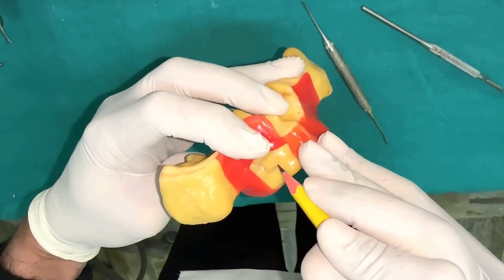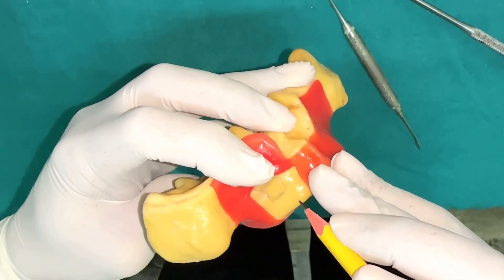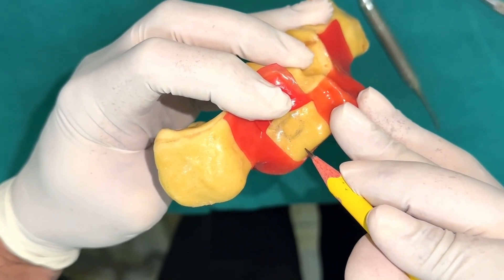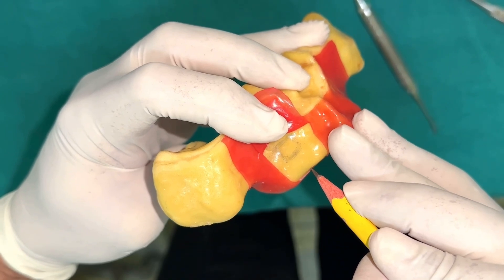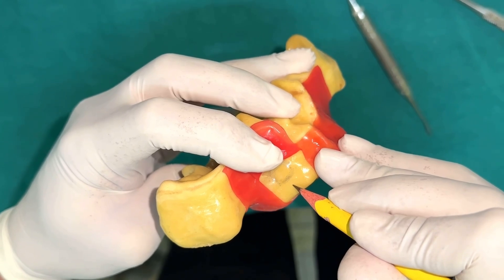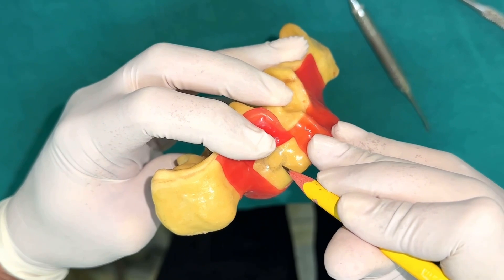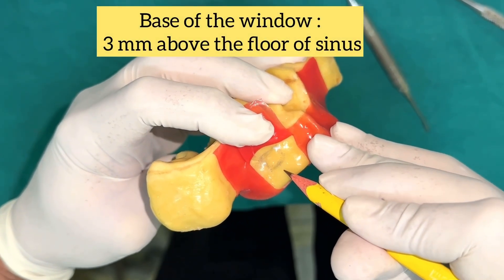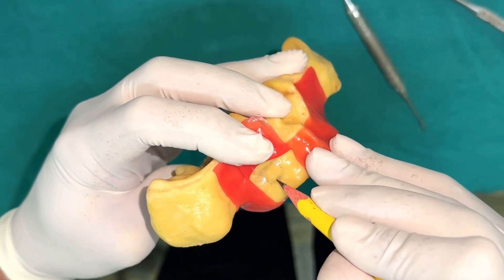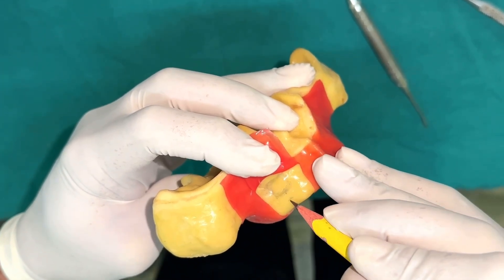The dimensions of this window basically depend upon the extent to which we require bone augmentation to be done. Suppose we are doing it with regard to implant placement in this area, and the residual height is roughly three millimeters or so — according to CBCT, the base of the window should be roughly three millimeters above that height of the ridge, so that retention of the bone graft occurs. This is the window which has to be made.